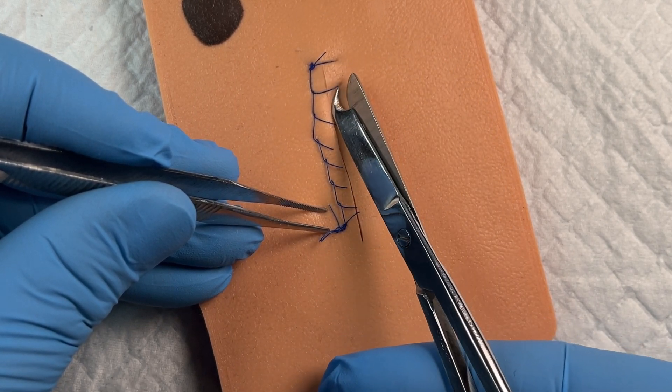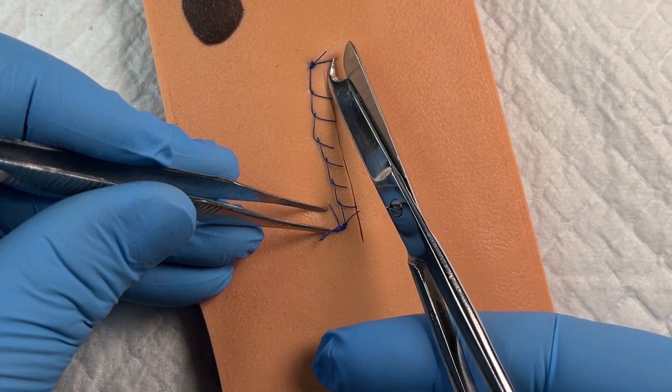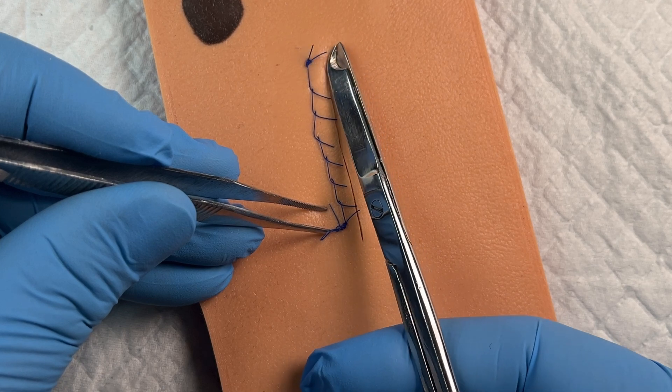So we're going to cut each one of these all the way up the full length of this laceration just like that.